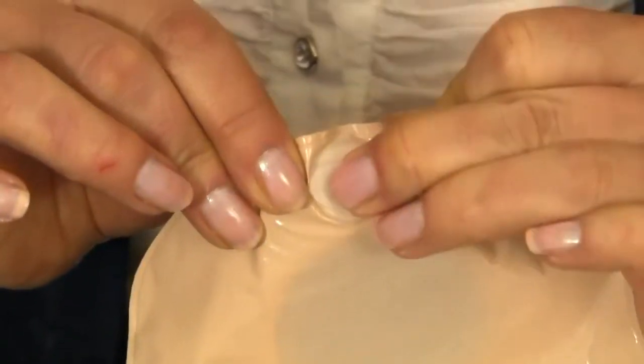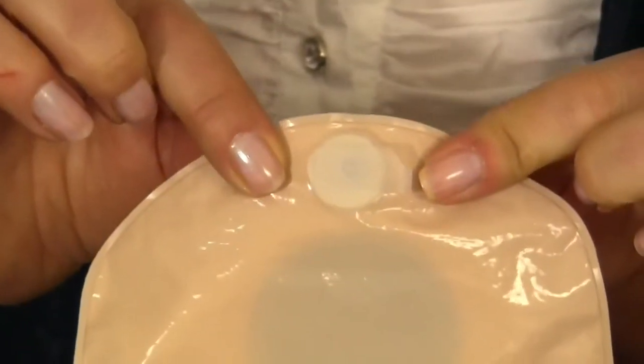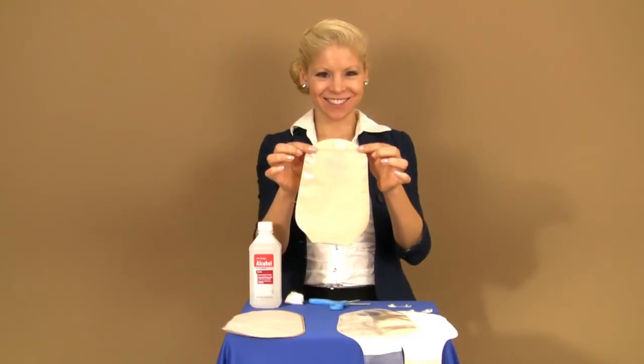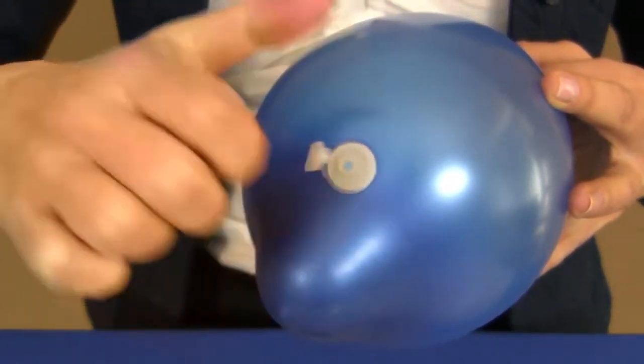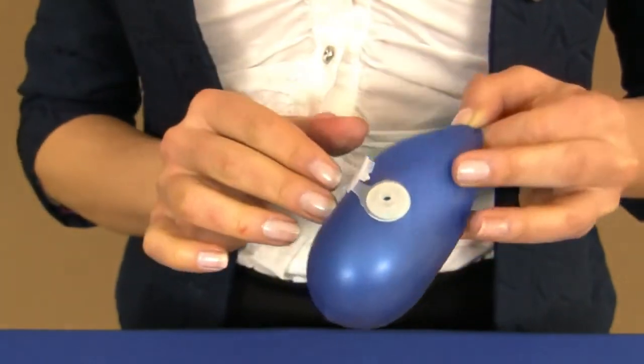Close the OstoEasy Vent and your pouch is ready for use. Once your pouch fills with air, pinch the sides of the OstoEasy Vent to release the pressure.